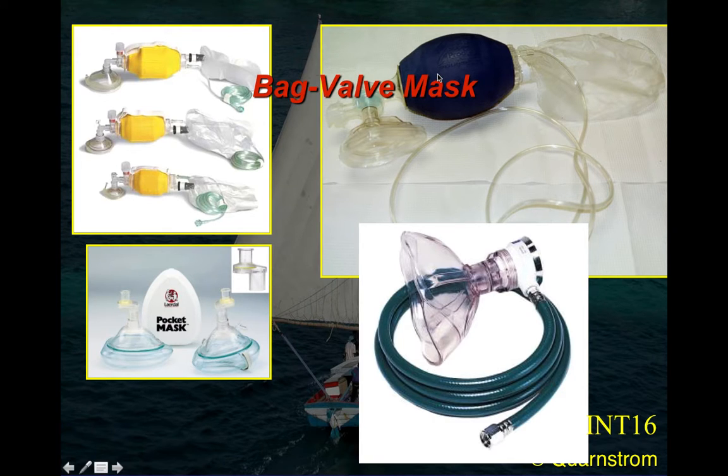With a bag valve and mask, if you don't have an open airway and you're inflating their stomach, it'll feel very different. And that's why I encourage you, practice with this once a year. Have your staff practice with it. With this one, you don't get that feedback, and heaven forbid, if your oxygen and nitrous lines are reversed, and this is hooked up to the oxygen line, you're not giving 100% oxygen, you're giving 100% nitrous.